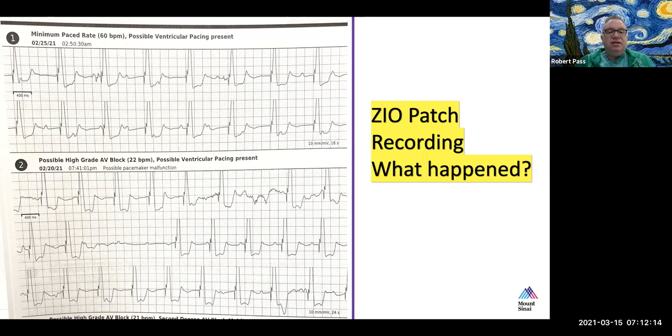And so basically, it happens in this patient that they had 2 ventricular leads. And so we were able to program the device to use the alternate lead. In this particular case, a dual chamber pacemaker was implanted and the 2 ventricular leads were plugged into the atrial and ventricular ports of the pacemaker, because there were concerns that the leads were not great. And so the patient had the pacemaker reprogrammed to pace through the other lead, and that was determined to be safe and to work properly. So presumably something happened to this lead, such as an insulation break.